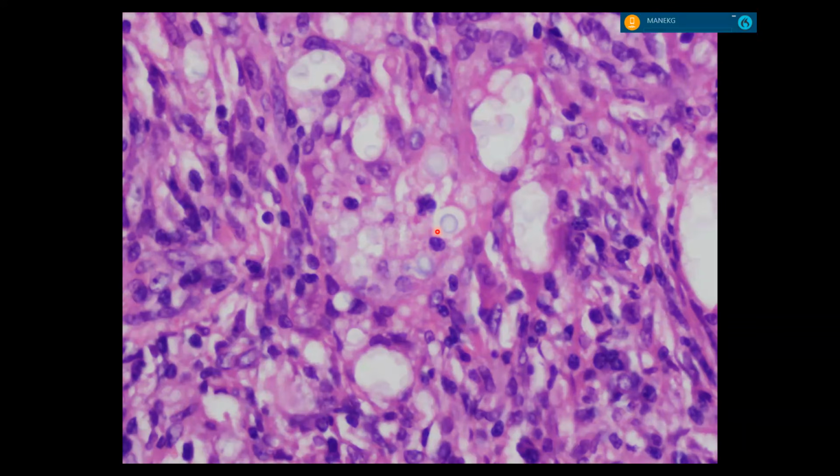It's not that big. It is not that. So this is the size of a lymphocyte. See that? It's about the same size. No, cocci is much bigger. Cocci would be the size of this big vacuole. See it? Like really big. Imagine a big thing filled with many smaller things. So kind of like a balloon filled with smaller balloons, that would be cocci.